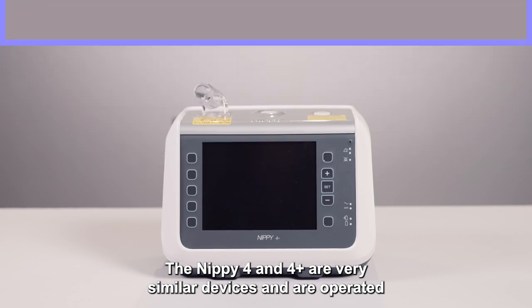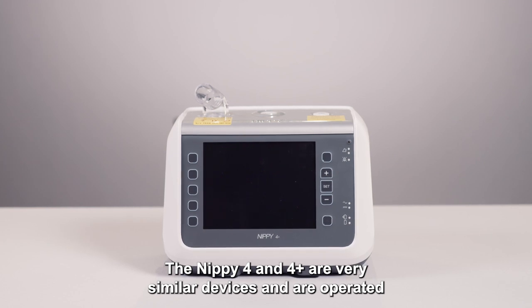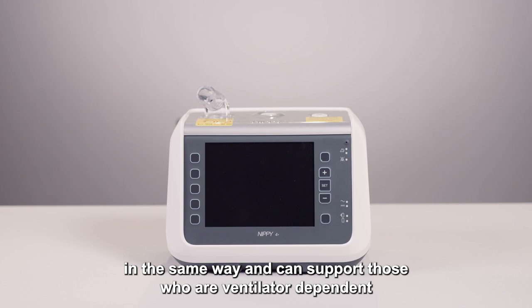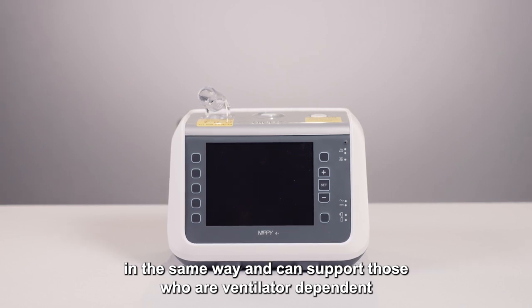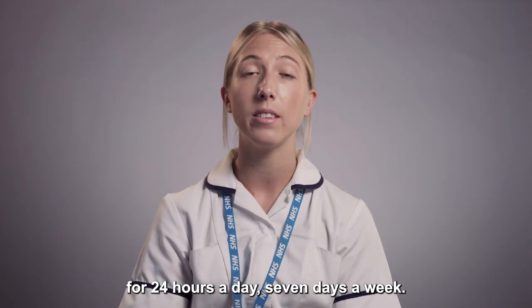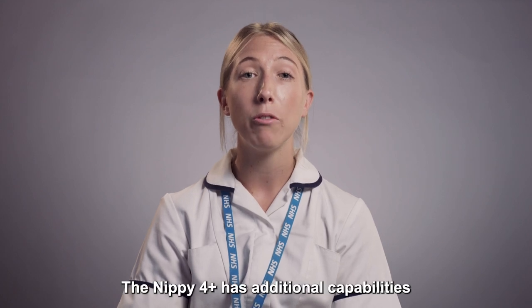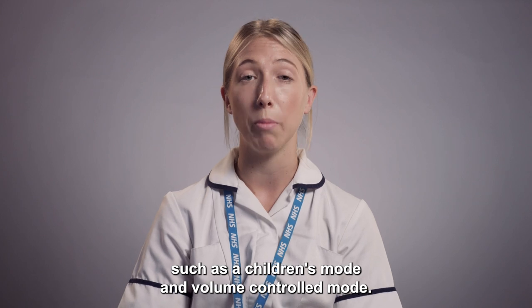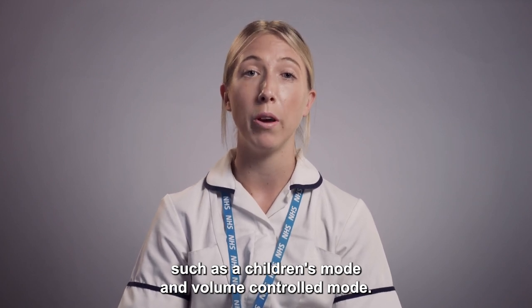The Nippy 4 and 4 Plus are very similar devices and are operated in the same way, and can support those who are ventilator dependent for 24 hours a day, seven days a week. The Nippy 4 Plus has additional capabilities such as a children's mode and volume controlled mode.